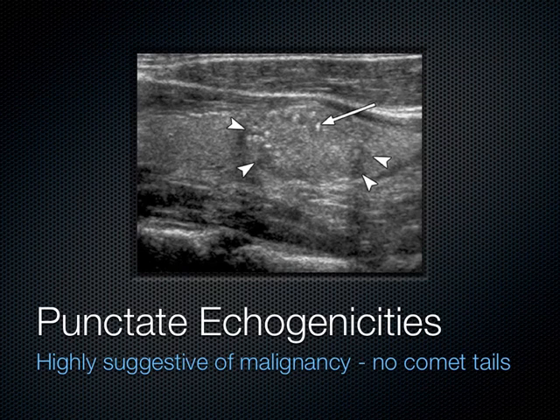Now, sometimes in these nodules, you'll see some punctate echogenicities, and what you want to wonder to yourself is, is there a cancer there or not? And it depends on if there are comet tails.